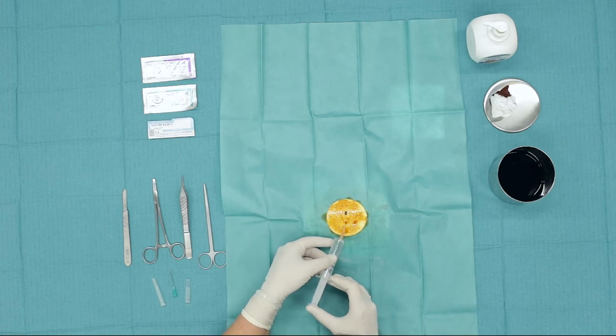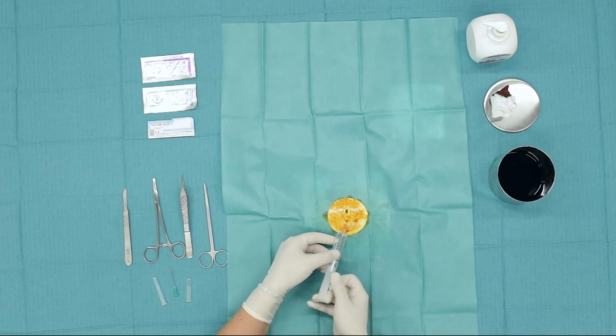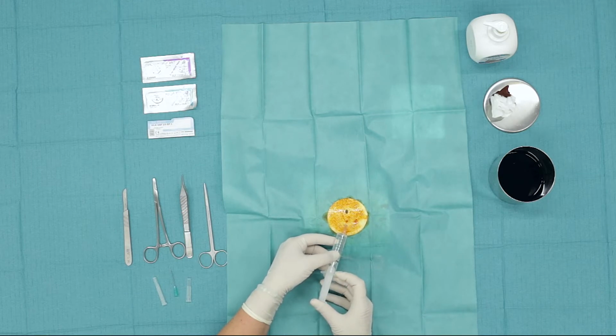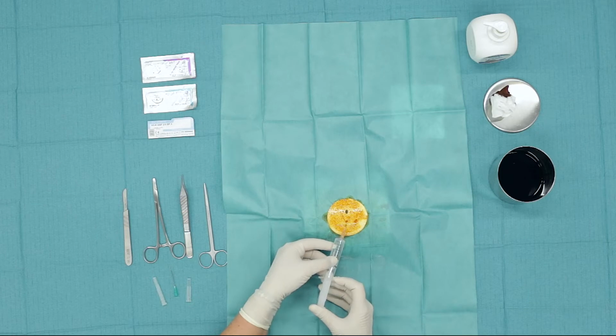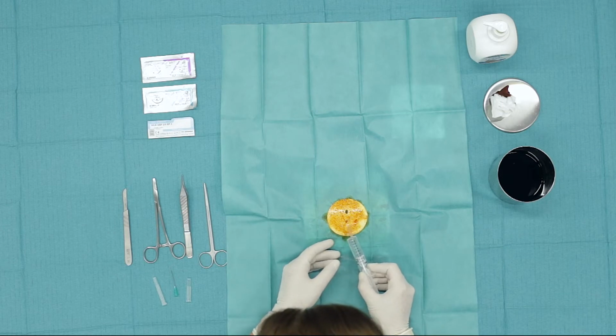Then, on the other side, again in the same way, suction and gradual administration of the drug by withdrawing the needle, in order to avoid multiple piercings of the patient's skin. In this way, the anesthesia achieved concerns this length of the incision.